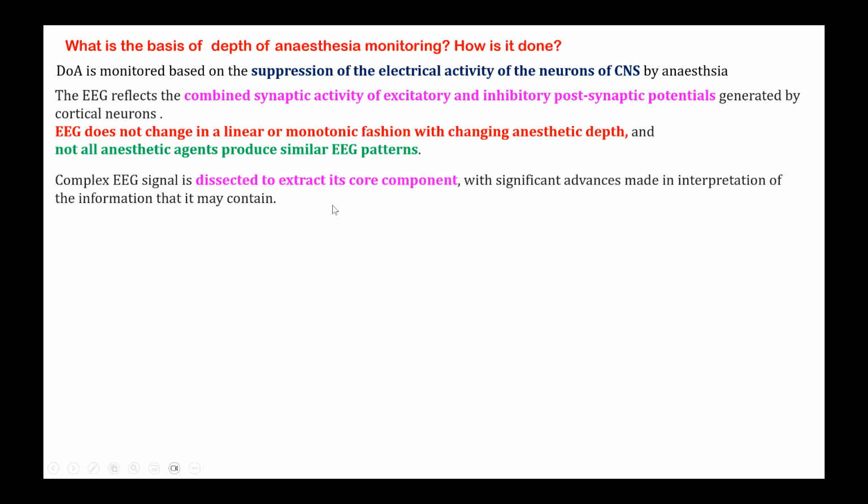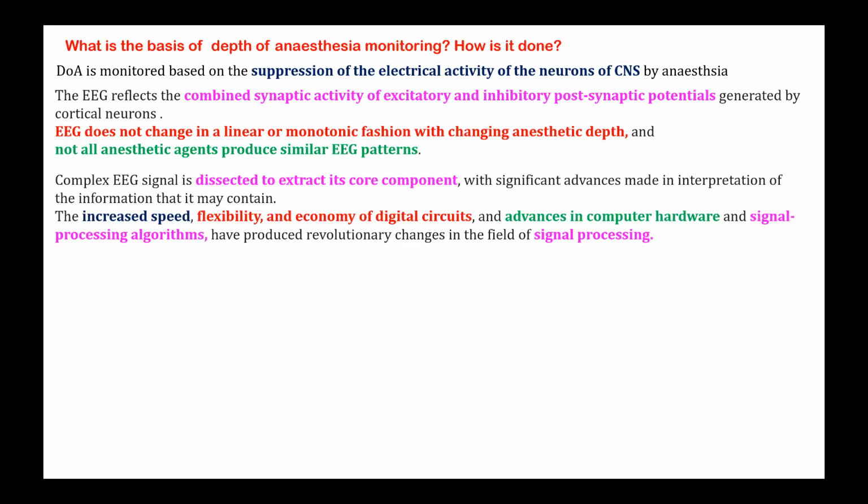And I think all of you have seen an EEG tracing being done for neuro patients. It looks like a very, very wavy pattern on a sheet of paper, unlike your electrocardiogram, which has a specific pattern. If you look at the EEG, it is all different types of wavy patterns.